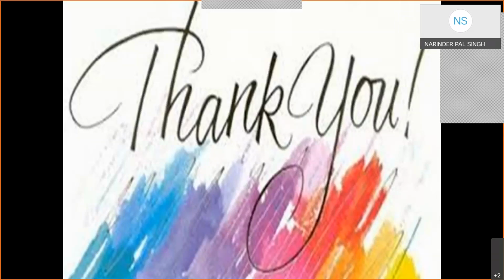What he's saying is the mustache sign is the inverted tick sign. Oh, that hockey stick sign, we used to call it. Now this is a mustache sign and inverted tick sign seen in digitalis application. So that's the same thing which we were talking about.